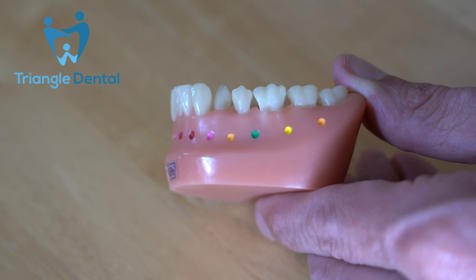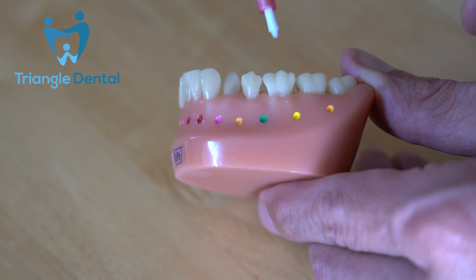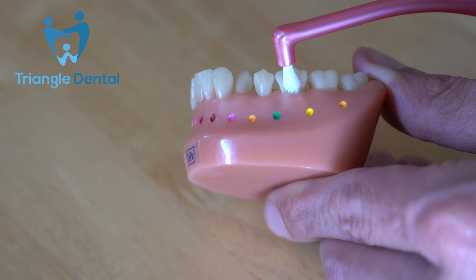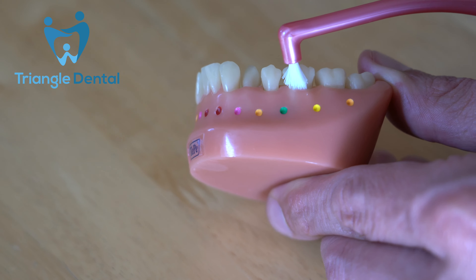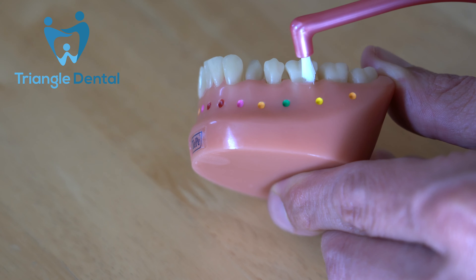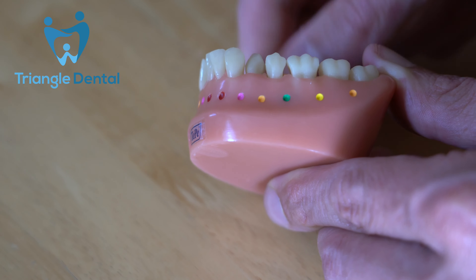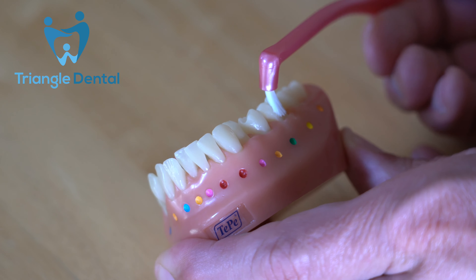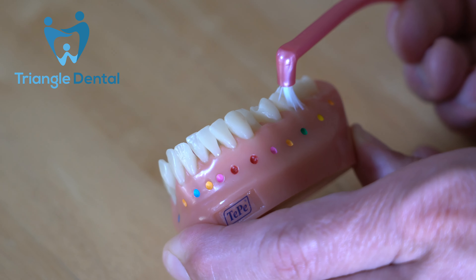An interspace brush is really good for cleaning down deep gum pockets. To do that, we take the brush and angle it at 45 degrees towards the tooth. When you push the bristles against the tooth, they splay outwards. Once the bristles have splayed, they can advance down the gums and actually clean right underneath that gum line. If I show you from another angle: the brush approaches the tooth at about 45 degrees, the bristles start to splay, and then they can fit down the gum pocket and be moved left and right to clean down that gum pocket.